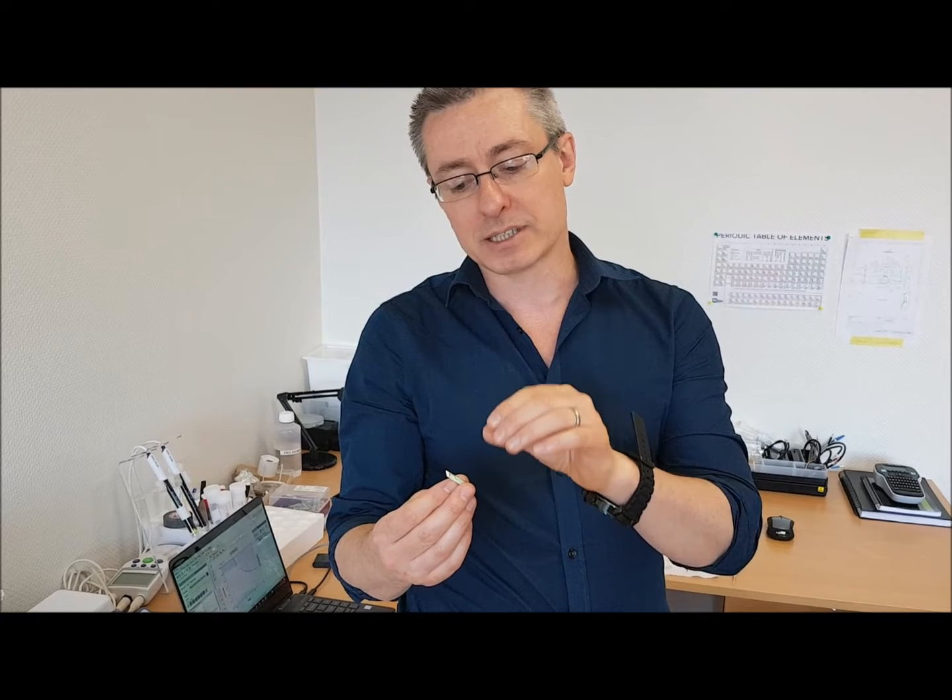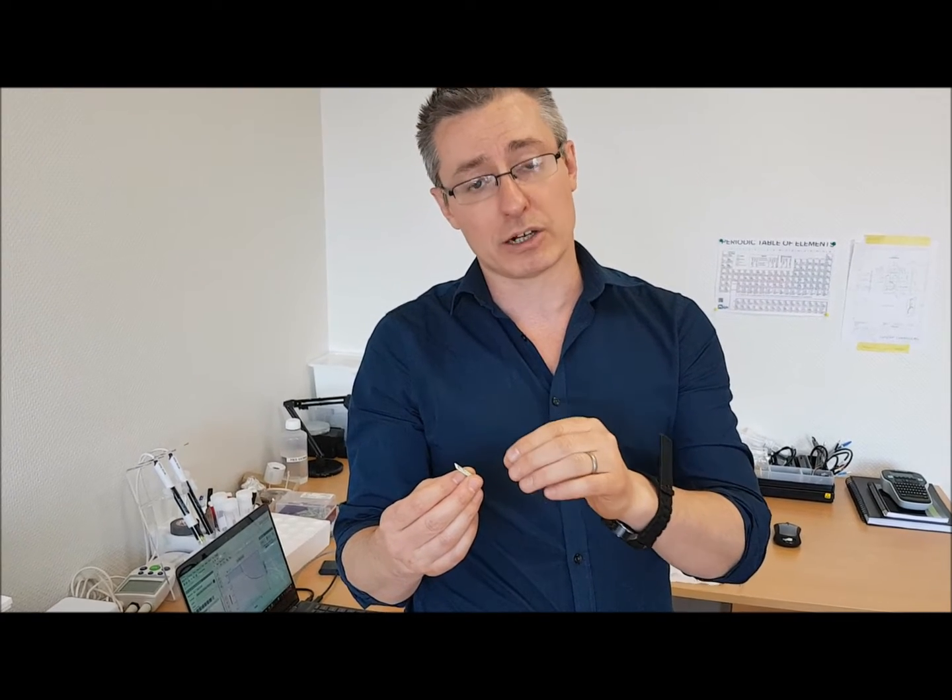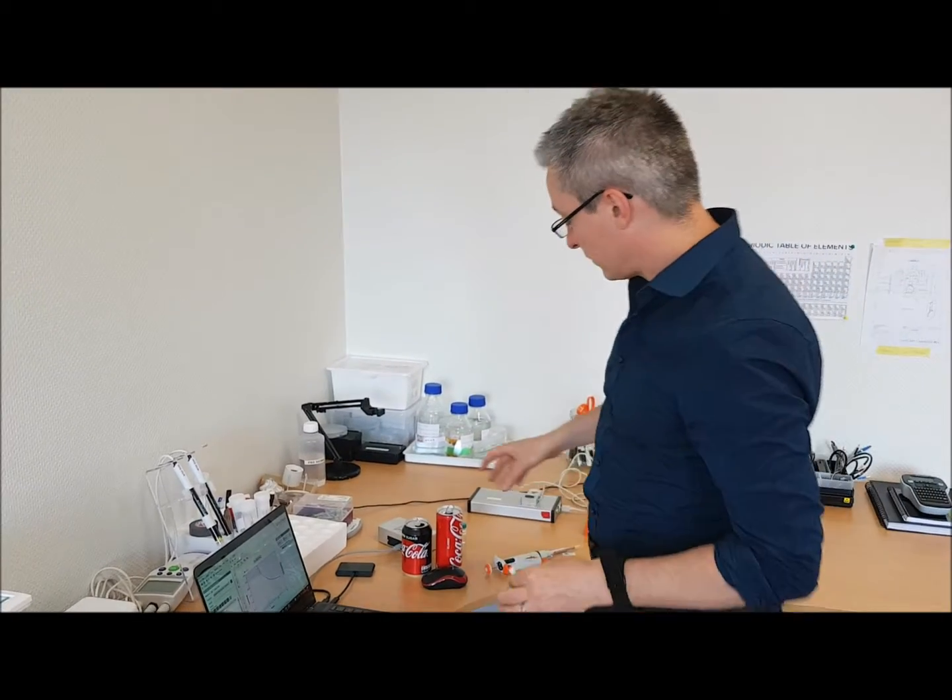In continuous mode, the enzymes are bound to the electrode, so if you put a solution on it or flow a solution through, the enzyme and active materials will not be washed away — they remain on the electrode. So it has two functions: it can be used just once to measure something, or you can put it into a solution or flow stream and it will continuously monitor.